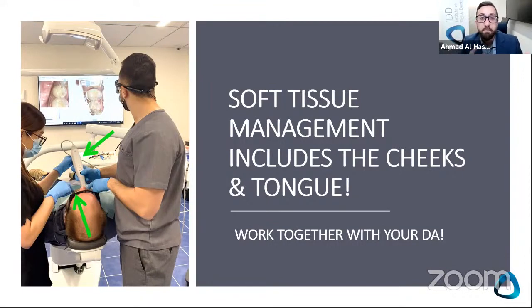Get the DA to hold the wire with her free hand because it makes the scanner feel a bit more weightless. Because if the wire is hanging down, it's almost like you're working against gravity. So yeah, the DA should be retracting.